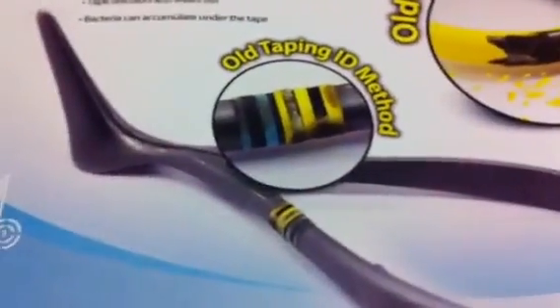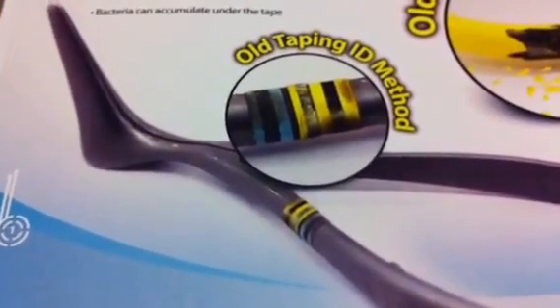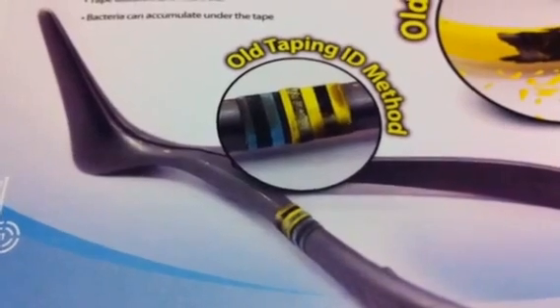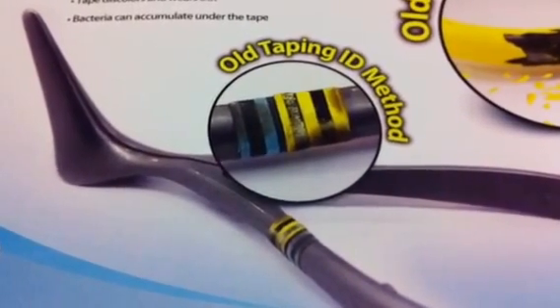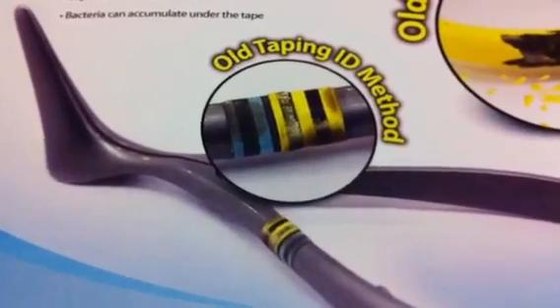With taping, the tape starts to wear out and discolors over time, bacteria can accumulate under the tape, and of course taping is an absolute pain in the neck to put on and take off.